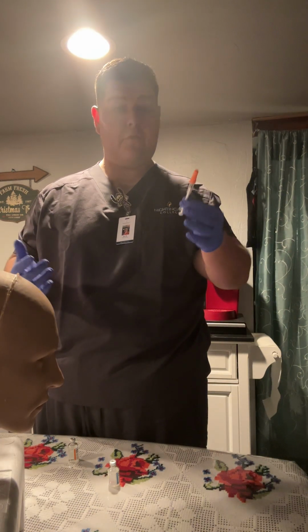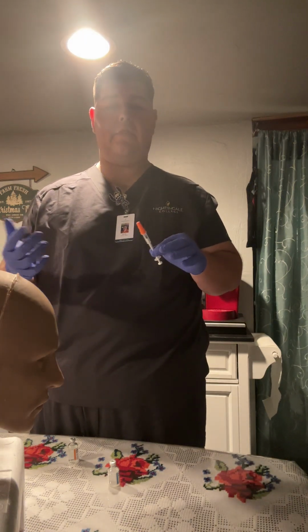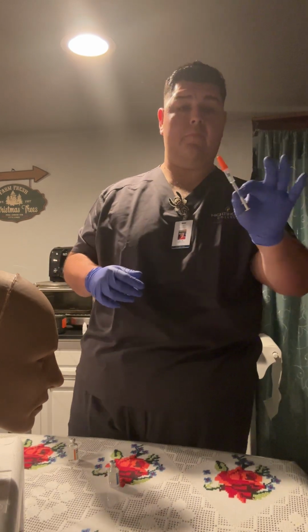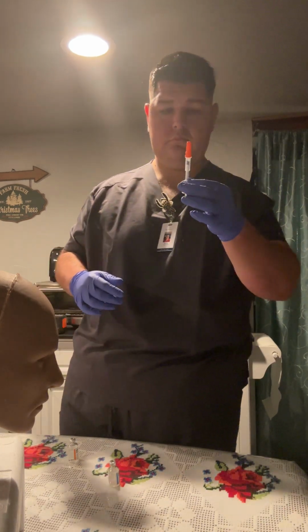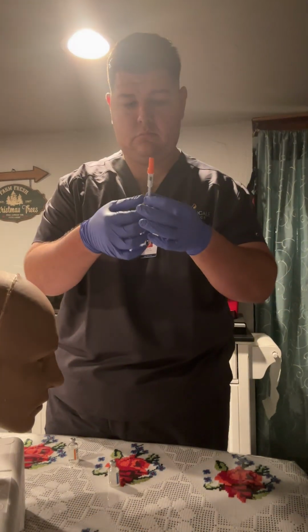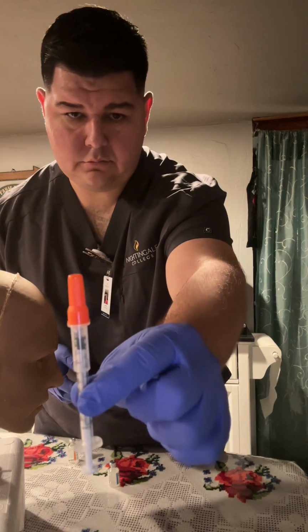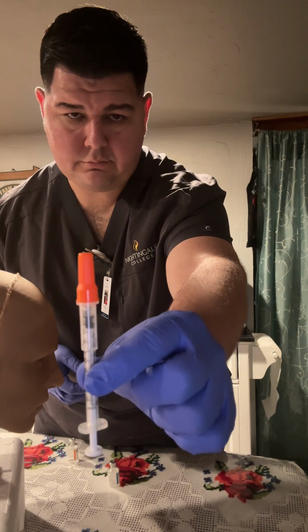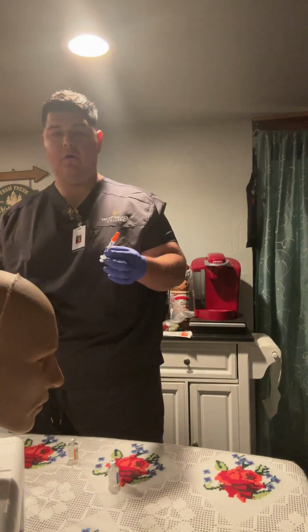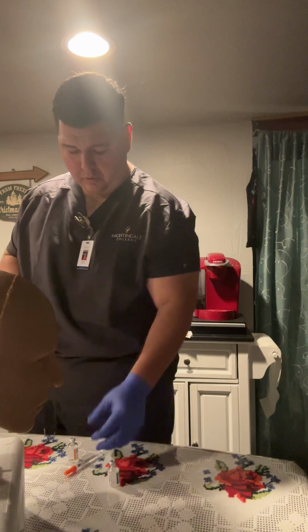So, for the final and last time, I want to verify the medication with the MAR. This is the 12 units of insulin for my patient. And this is very hard to see. Okay, medications are ready to go. Let me go ahead and put that down.